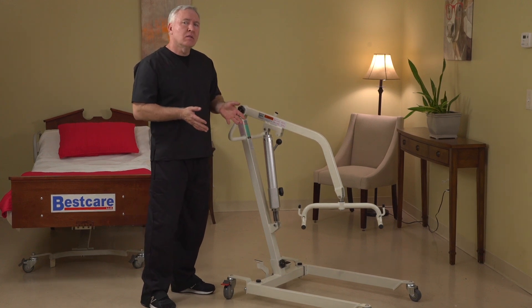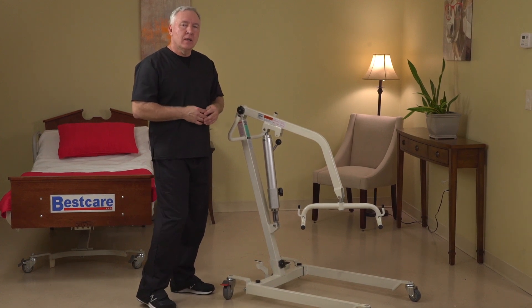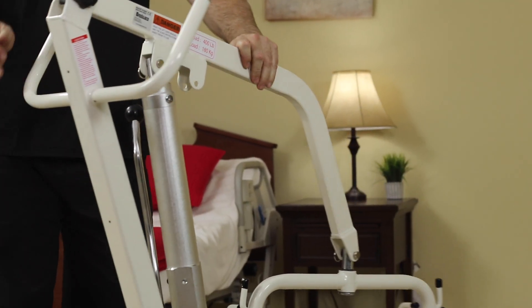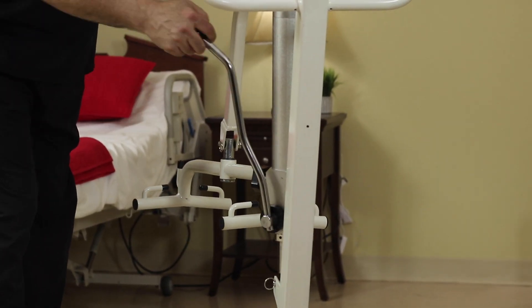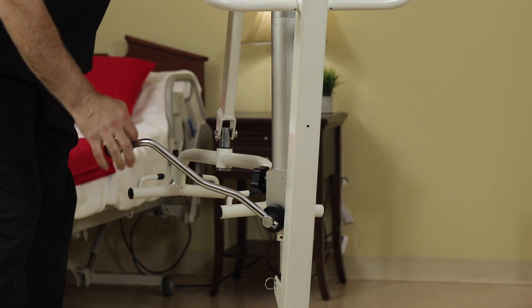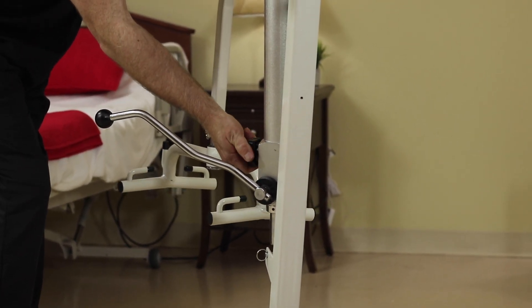It's very compact, comes apart without tools, and can be transported quite easily. The unit is easy to raise and lower by simply pumping the handle on the side to bring the unit up, and turning the knob on the bottom to lower it.